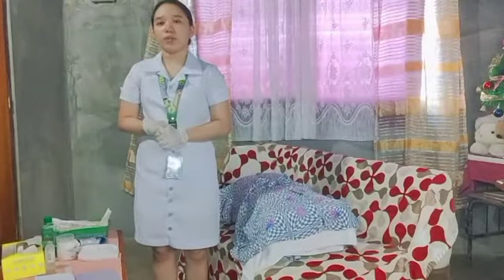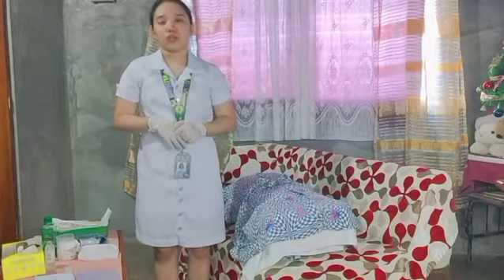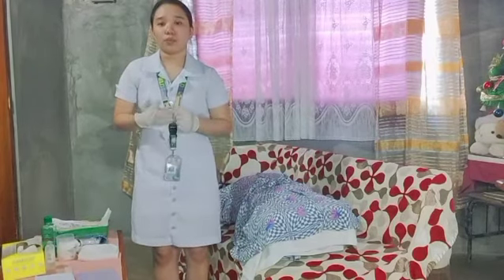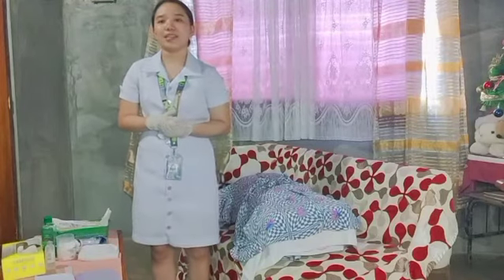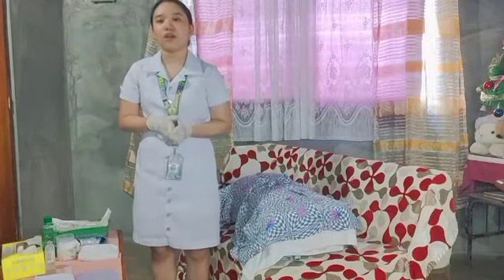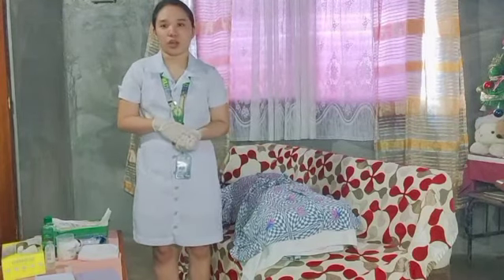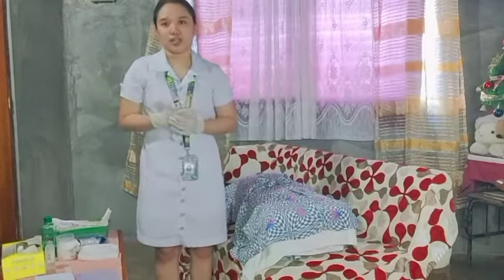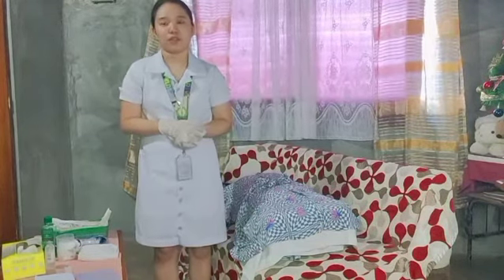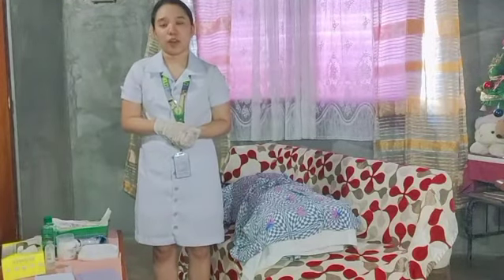So now we are going to assemble the equipment and supplies such as a sterile catheter of appropriate size, 1 to 2 pairs of gloves, waterproof drapes, antiseptic solution, cleansing balls, forceps, water-soluble lubricant, urine receptacle, and specimen container. For an indwelling catheter, you should have a syringe prefilled with sterile water in the amount specified by the catheter manufacturer.